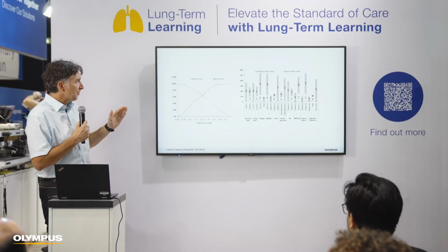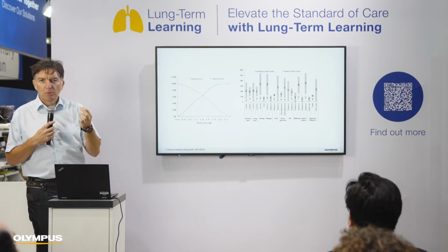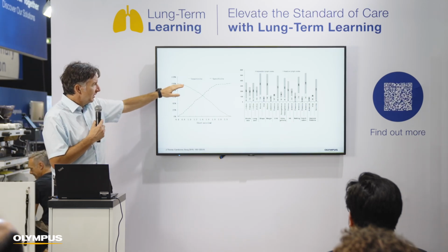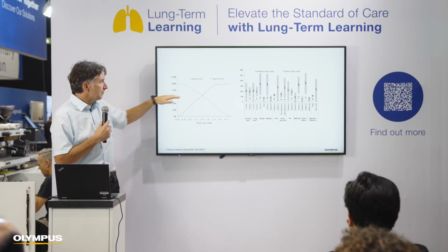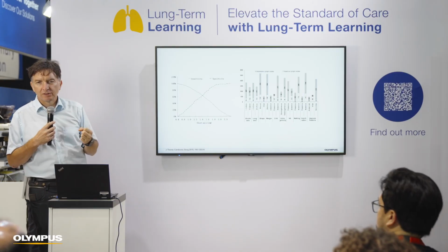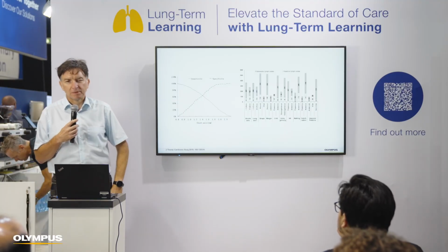So what I wanted to tell you is that we have 2 curves in all these studies. Everything is approximately similar. One is specificity, one is sensitivity. If you want to be more specific, then our sensitivity drops. If we want to be very sensitive, then our specificity drops. And when these two curves come together, we get a sort of accuracy, or the possible diagnostic yield of B mode. As you can see, it's around 70, 65%, which is 20, 15% less than cytology. So that's basically the range of B mode.